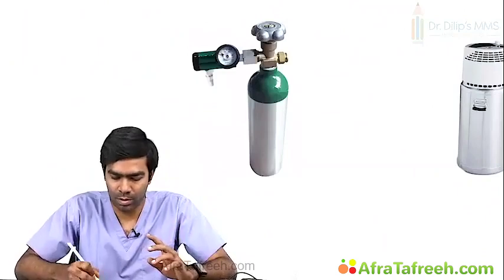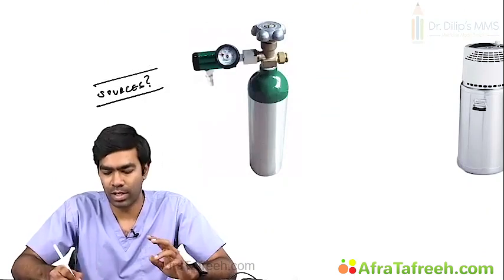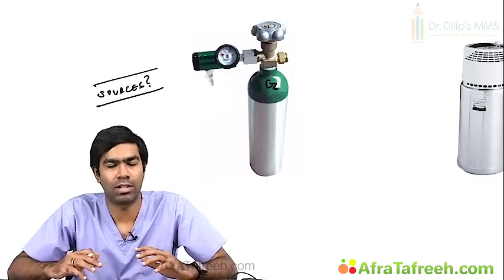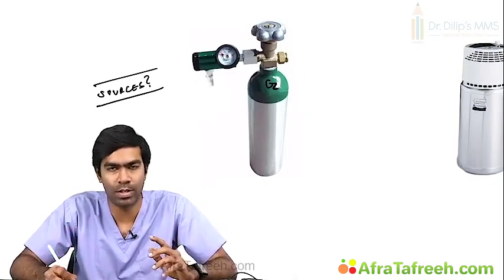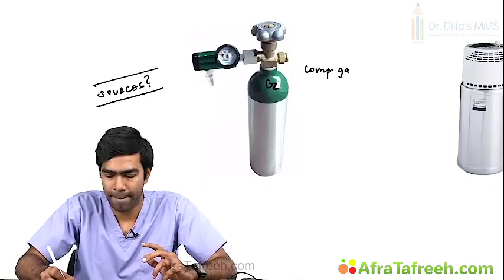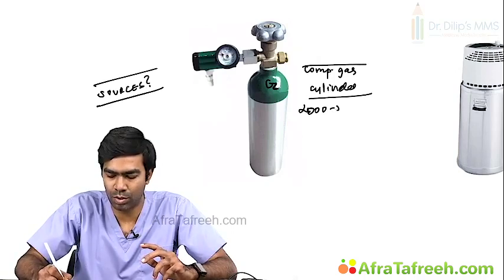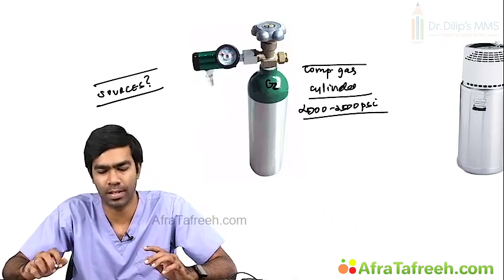Okay, you have discussed the delivery devices to the patient, but what are the sources of oxygen? This is one traditional green color coded cylinder. You know, this must be oxygen, green color coded. So this is nothing but a compressed oxygen cylinder, which usually holds compressed gas at a pressure of 2500 psi, even though they can go up to 3000 psi.